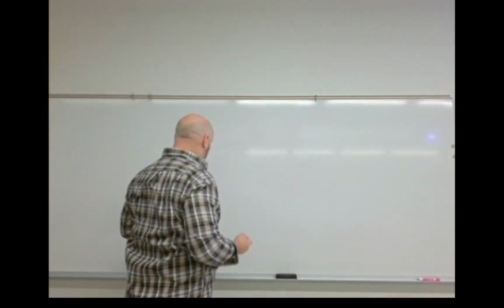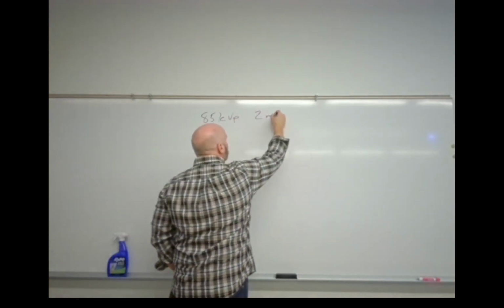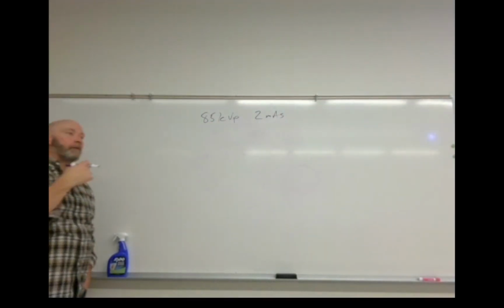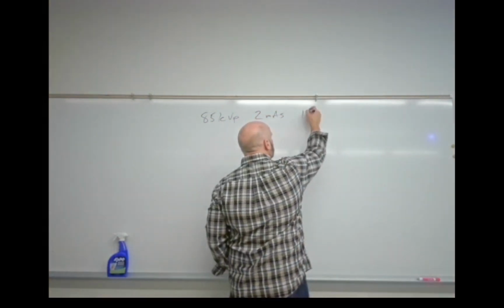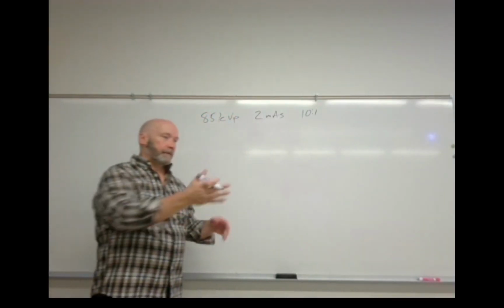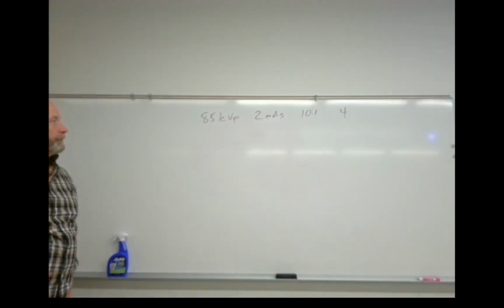So let's say you've got an order for a chest x-ray and you shot the chest x-ray at 85 kVp at, let's say, 2 mAs, and the patient has a pleural effusion. Okay, so they say, I want you to go back up to the patient's room and this time use a grid, and the grid that you have is, let's say, a 10-to-1 grid. And, you know, don't look back into the book and look up the Bucky factor. I'm just going to give you a Bucky factor of 4. Okay? So let's say our 10-to-1 grid has a Bucky factor of 4.